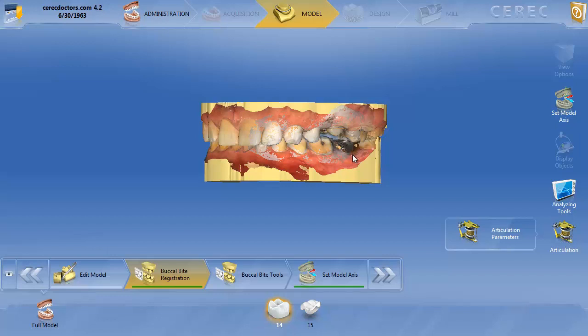In this second video on virtual articulation, we're going to really go into some of the details on how this articulator actually functions. Basically, this articulator is what we call an average value articulator. We all have articulators in our office — some are semi-adjustable, some are fully adjustable articulators. This is an average value articulator.